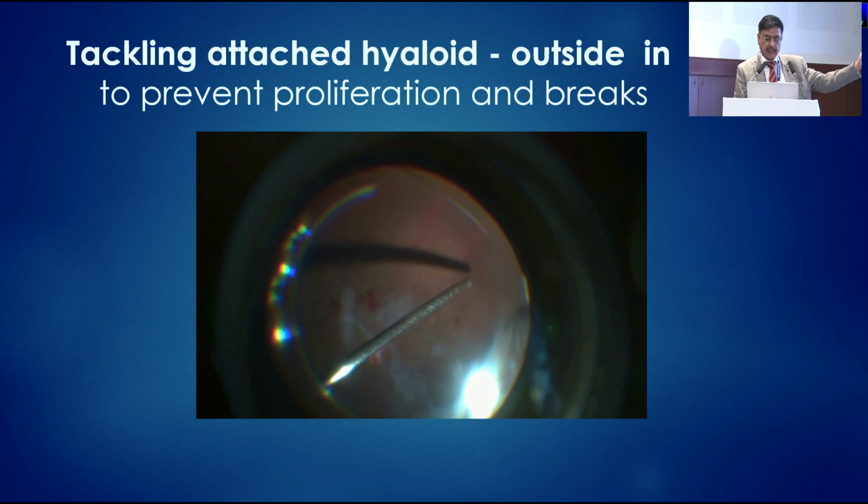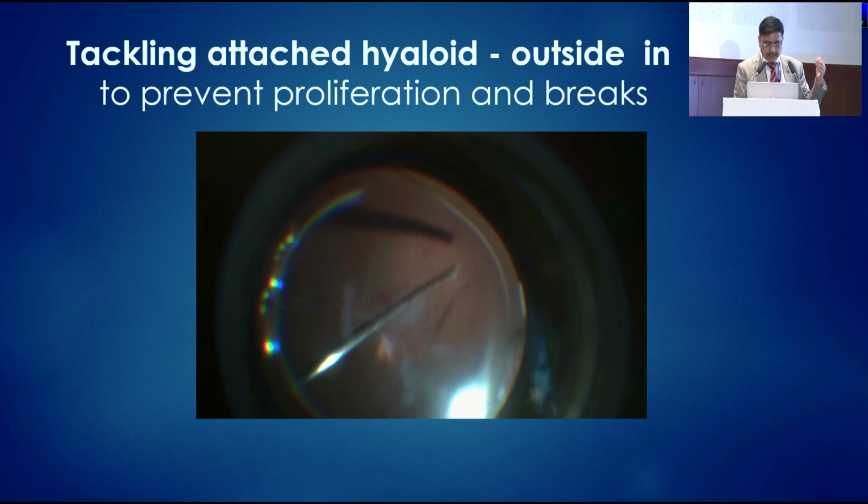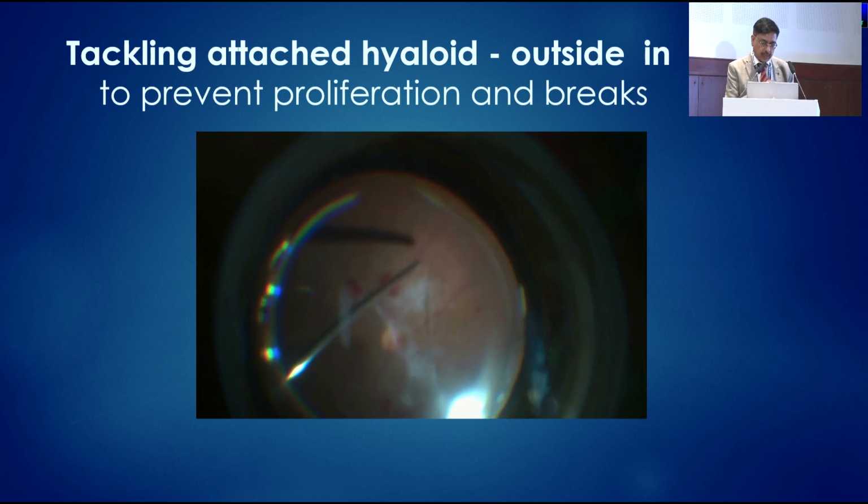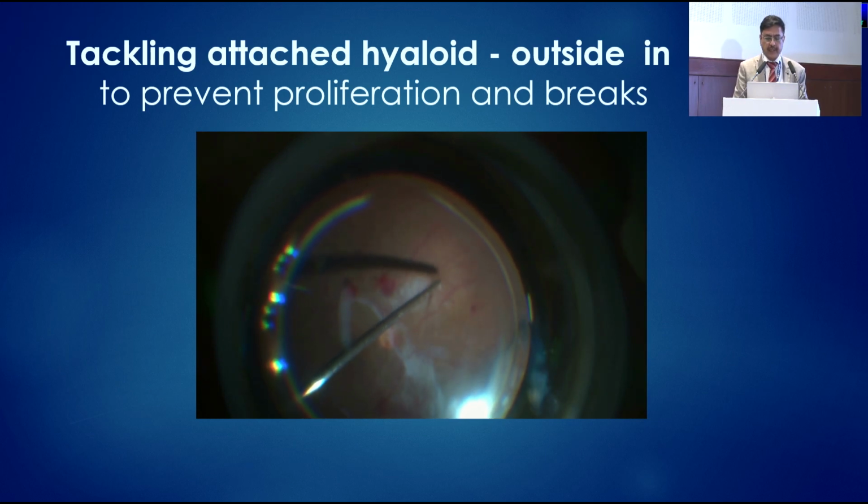very well. And then you cut across, and then you have gone into the right plane. As Hemant would also show, going to the right plane is the surgery half done.